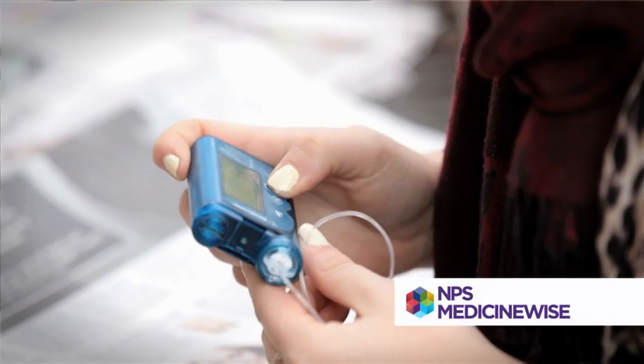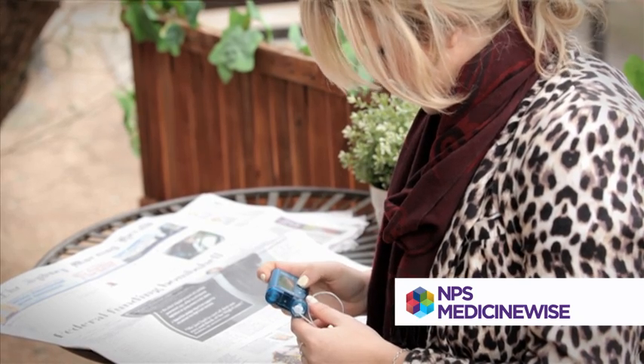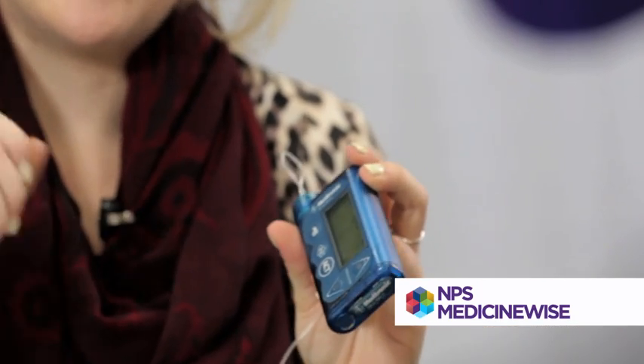It has a menu, and you go through and just select the carbohydrate amount, then it asks what your blood glucose level is. You put that in, and it tells you how much insulin it's going to put in. You can adjust it, but it's recommended that you don't.